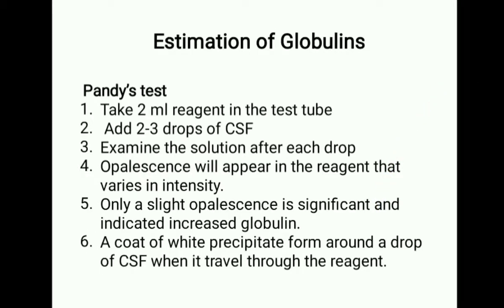Next, we have estimation of globulin. For estimation of globulin, the Pandy test is performed. Talking about the procedure, take 2 ml reagent in a test tube, add 2 to 3 drops of CSF, and examine the solution after each drop. Then you will see some cloudiness, like a milky solution. An opalescence will appear in the reagent that varies in intensity.